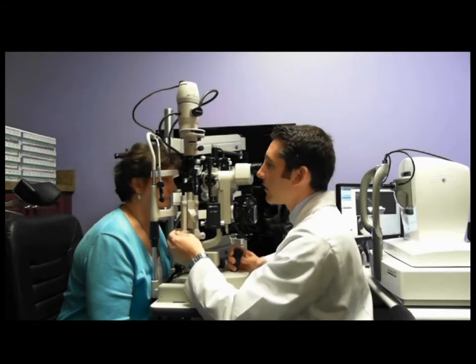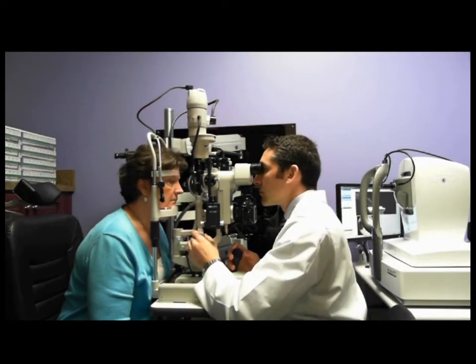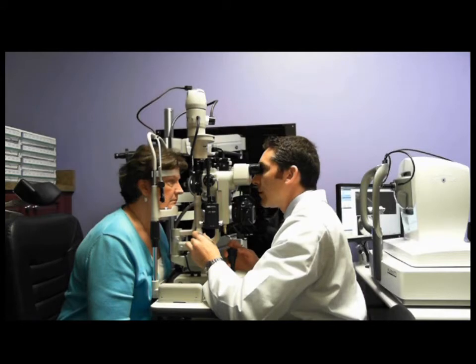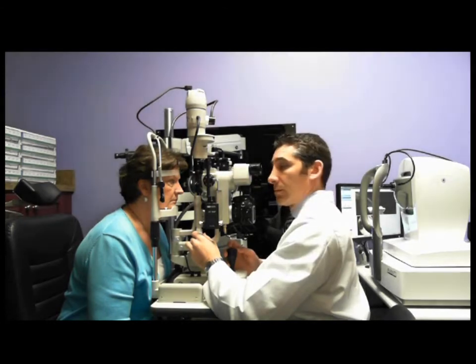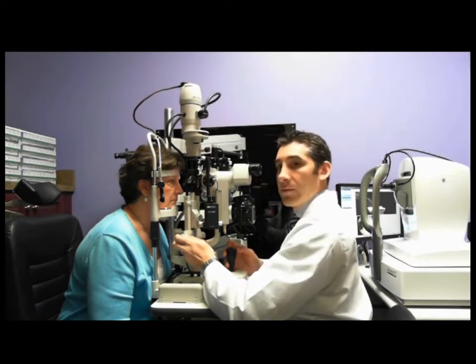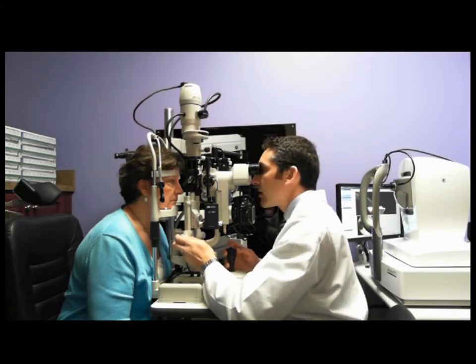Let's inspect the haptic here. Darlene, take a look off to the left for me. See here, we get a little bit of compression of these conjunctival blood vessels. So we're going to change this when we make our first lens order. Now look up for me. Look straight up. That's it.